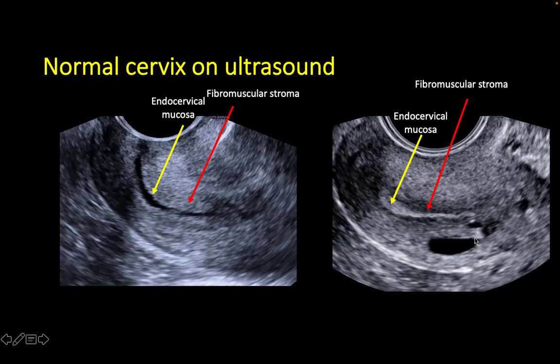In addition, in the posterior lip of this cervix, you see at least two anechoic lesions. If you were to switch on color Doppler, they would not show any vascularity, and these are nothing but normal innocuous Nabothian cysts or follicles, which we see often from time to time in the cervix. They can be single, they can be multiple, they can have variable size, they can appear anechoic, that is totally black, or can show some amount of echoes within them, especially when they get infected. They are totally harmless and nothing needs to be done about them unless they are symptomatic.